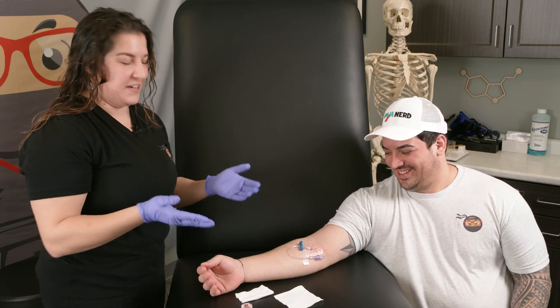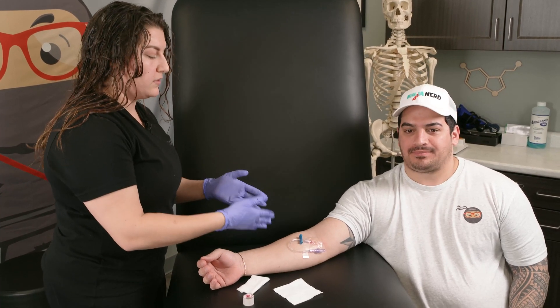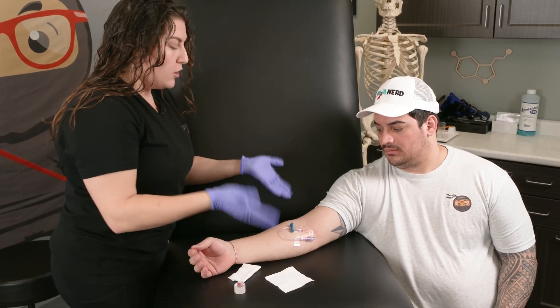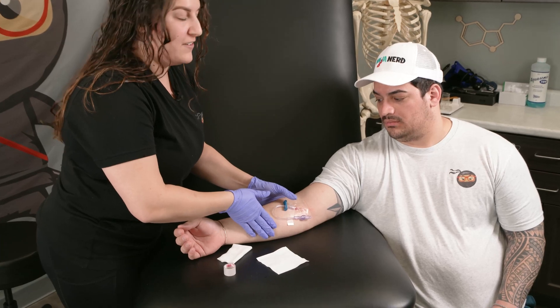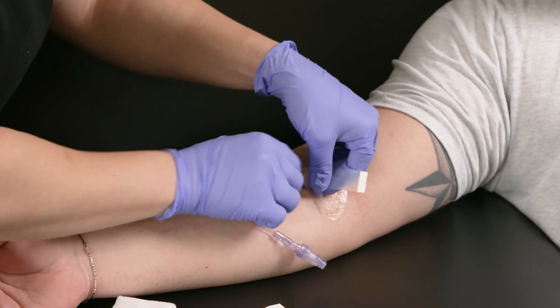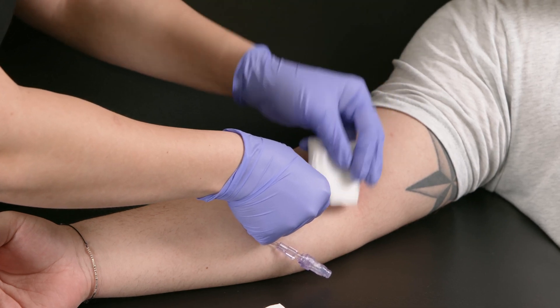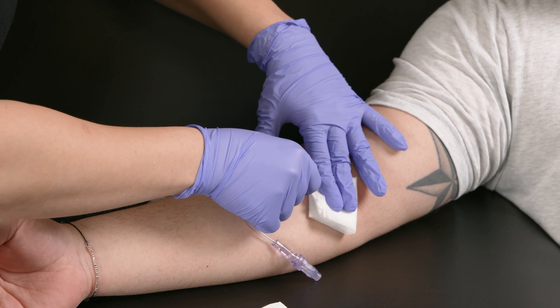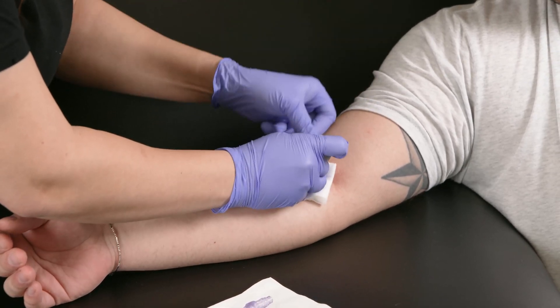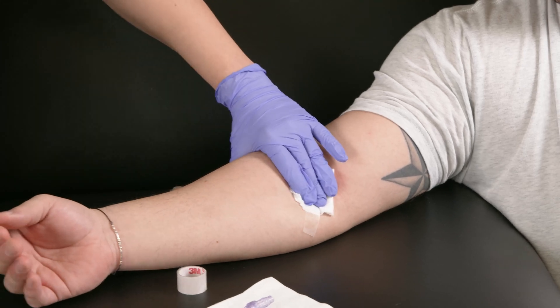Now we're going to take the IV out. When we take the IV out, we still put gloves on. All we're going to need is some gauze and some tape. When you take it out, it is sometimes a little bloody — patients don't like to see their own blood. I always tell them this usually hurts more than the IV stick because you're ripping tape off the skin. I hold the first tubing and take off that little piece, then as I remove it I hold the catheter nice and stable. Tegaderm is now off. Take the gauze, put it over top first without applying pressure, then as you start pulling it out apply pressure so it's nice and secure. Tell the patient to keep pressure on it because it's a vein that's going to be exposed. Then apply tape. The IV is now out.